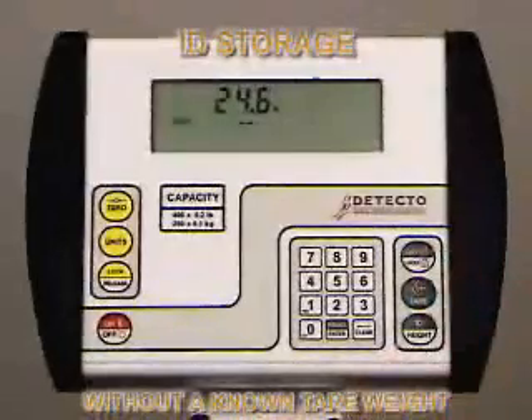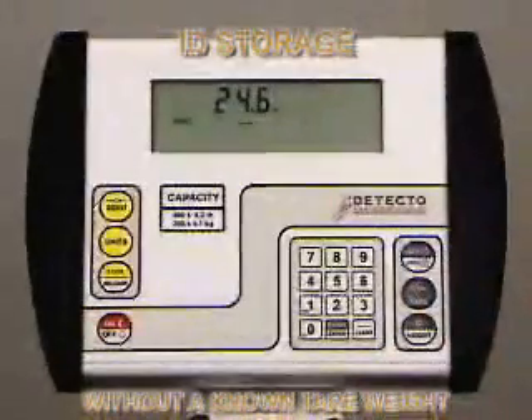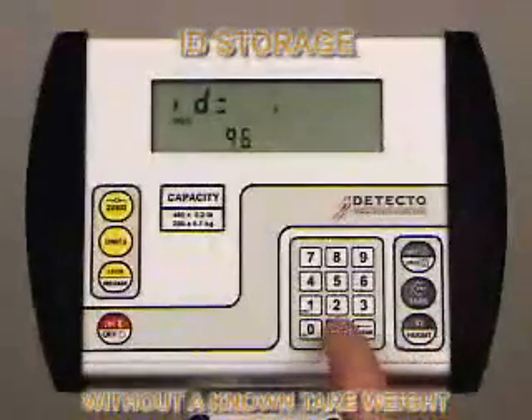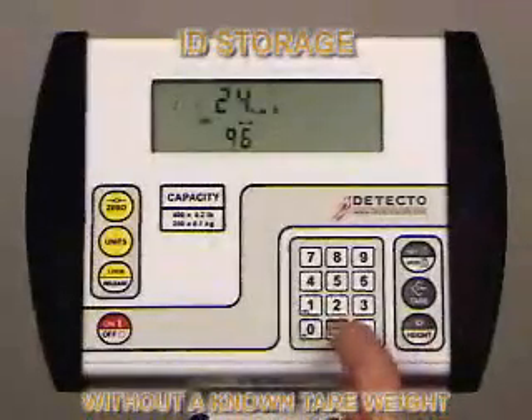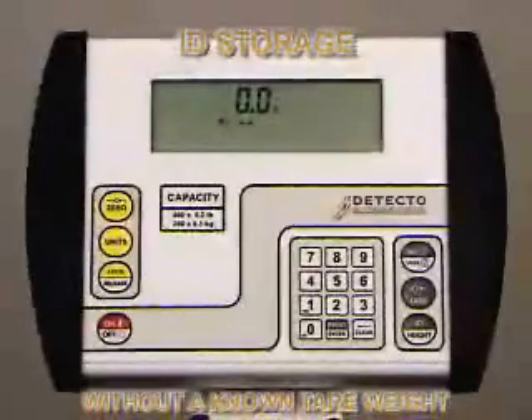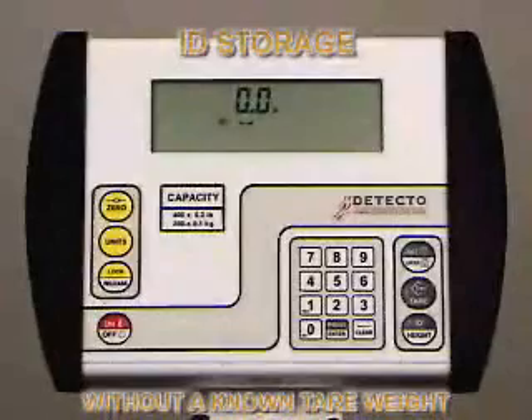The display will show 0.0 and the tare enunciator will be displayed. Press the Tare key. The weight display will change to 0 and the net enunciator will illuminate, indicating the net weight is being displayed. The item's weight has been entered as the tare weight. To recall the ID, press the ID Height key and the 758C will show the last ID entered. Pull up the value you want, then push the Enter key.